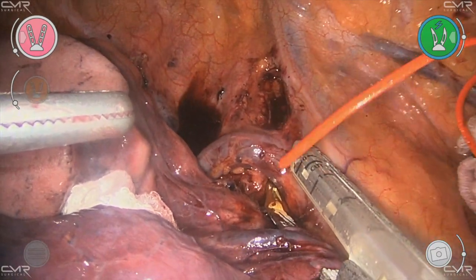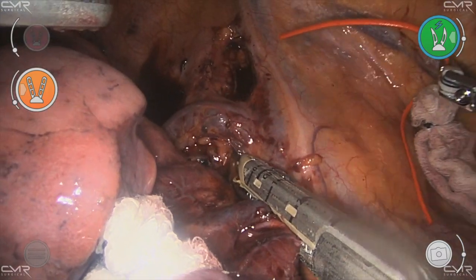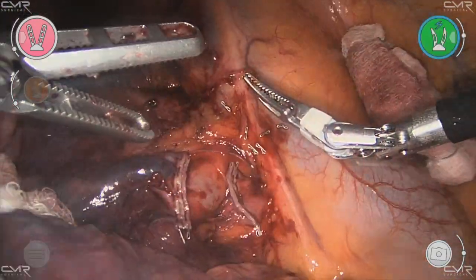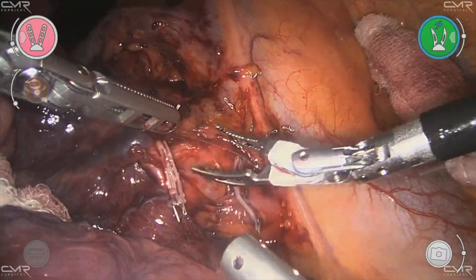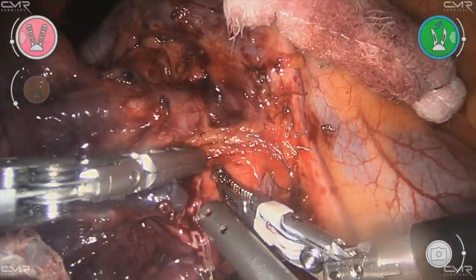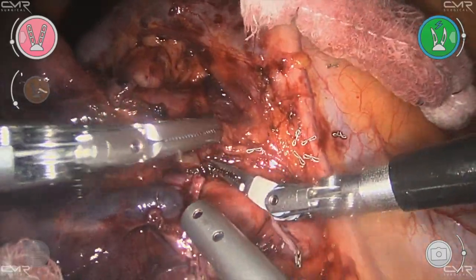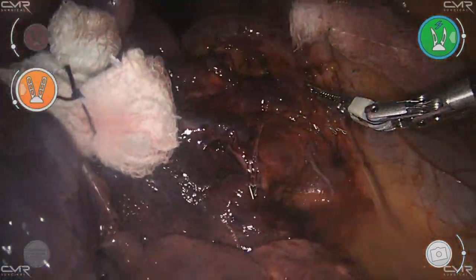The camera icon bottom right shows the angulation. There are little dots on a semicircle either side of the circular icons indicating how wound up the instruments are — they can't go limitlessly and there's an easy press function to unwind if needed. Coming to robotics from VATS, probably the biggest difference is giving over stapling to your assistant — you have to learn a language: rotate clockwise, anticlockwise, 12 o'clock, six o'clock, nine o'clock, articulating left and right. Quite useful to practice that. We've done the vein and now going towards the truncal branch, which we've cleaned nicely at the back. Just cleaning some station 10 lymph nodes out the way at the front, then ready for truncal branch stapling. The third arm just repositioning, lifting the right upper lobe up a bit.